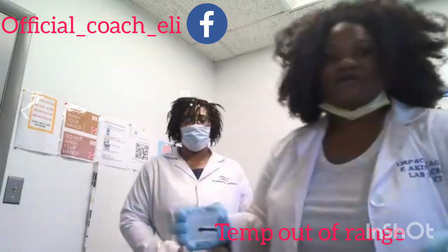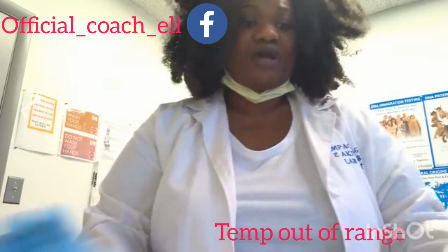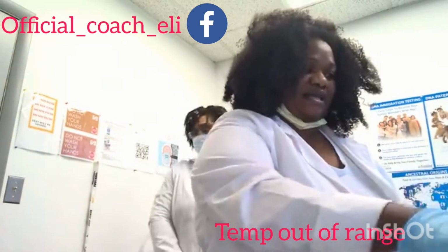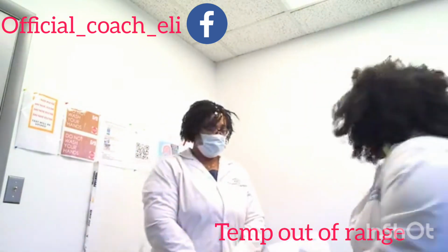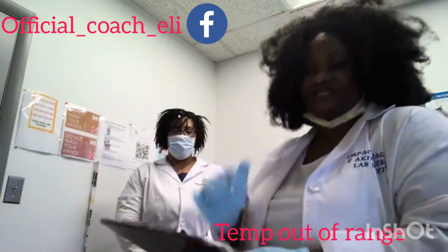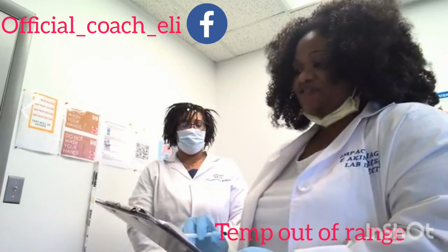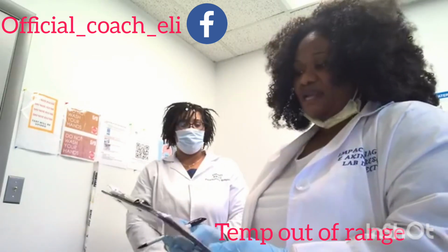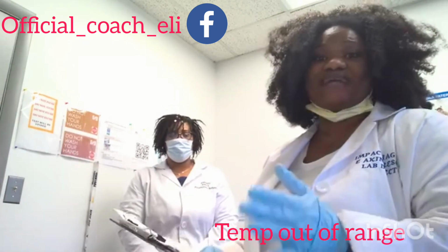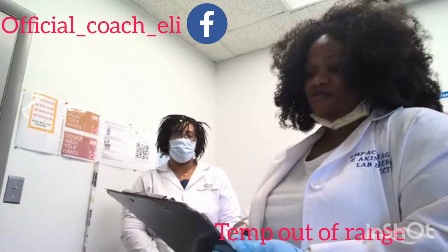So what I'll do is go ahead and still do my test. So before I do that, I'm going to go to step 2 of my CCF form, guys. I'm going to go to step 2 and see what step 2 is saying. So the question in step 2 is asking if it was a split collection, and the answer is yes, because remember, this is DOT, it's a split specimen collection. I'm going to go ahead and say yes, and it's a urine. All right, this is urine, and it's going to ask me, is the temperature in range? And I'm going to go ahead and say no, because the temperature was not within 90 to 100. And I'm going to go ahead and go to step 3.